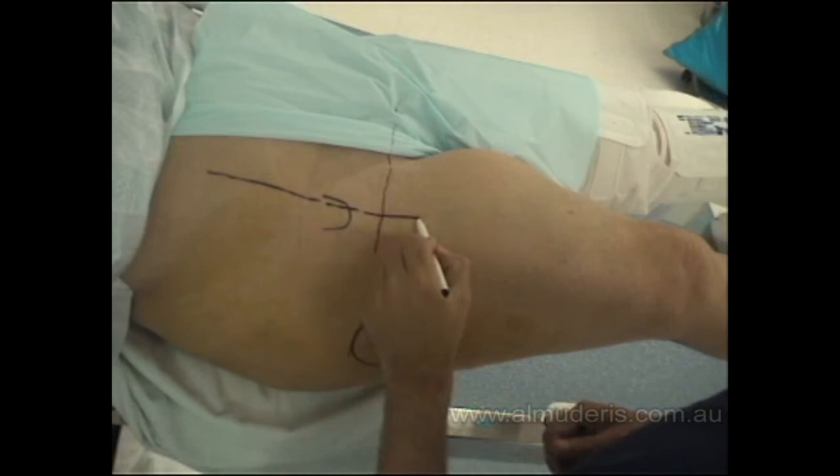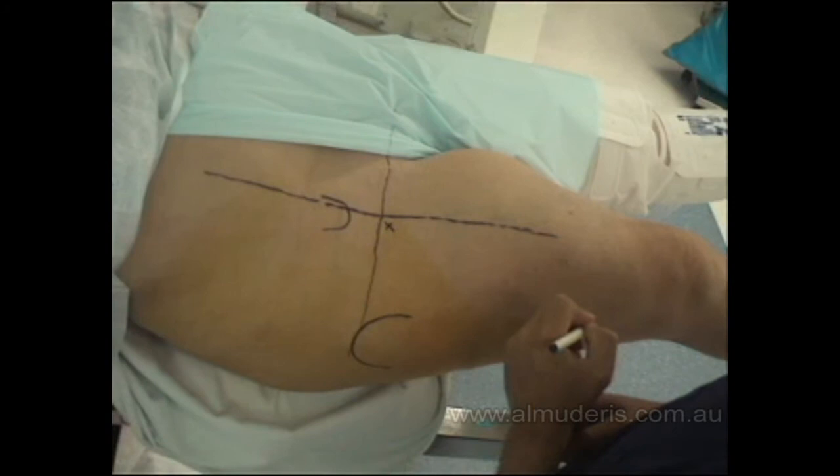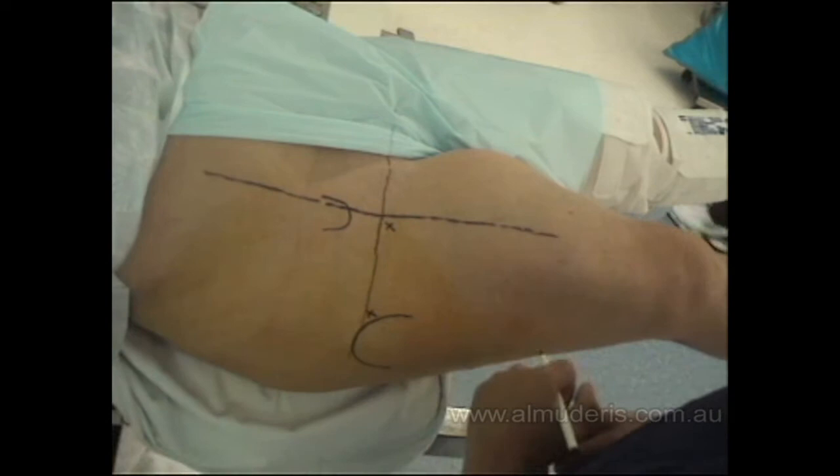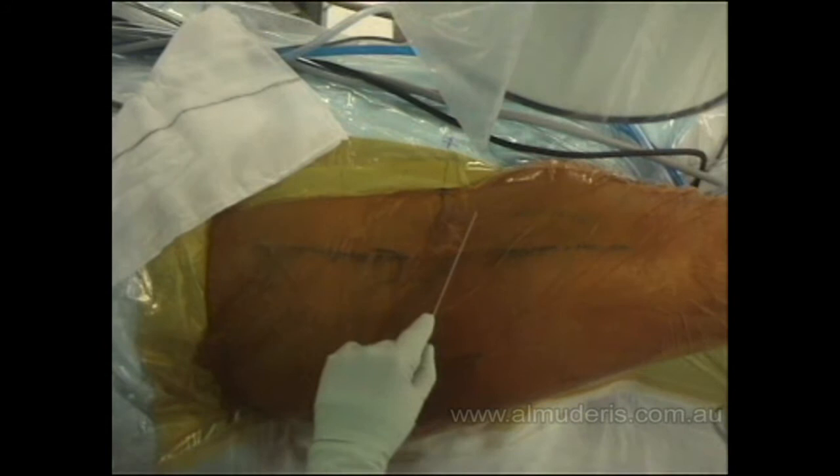Any structures medial to the portal line should be avoided. The incisions should be performed in the inferior lateral corner for the anterior portal, and the second incision is just anterior to the greater trochanter. This operation is performed under image intensifier control, so the first step is identifying the entry portals.